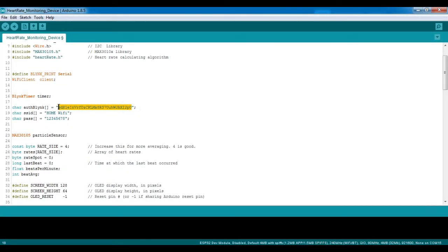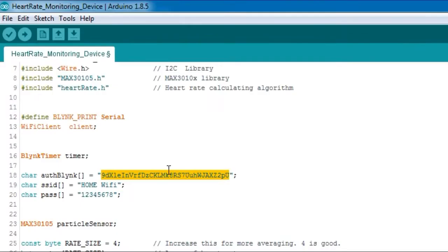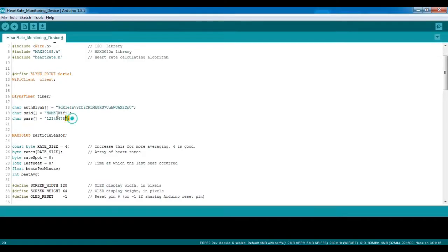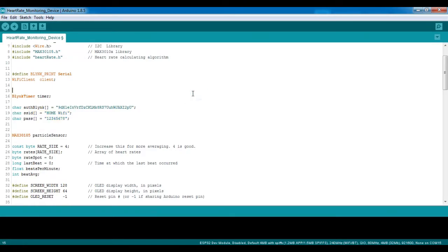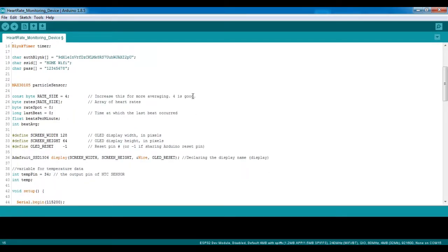I added my authentication key from Blink and you can always get yours if you want to display your own data on a Blink application. This is my hotspot name and my password so input yours if you are going to be building upon this code.